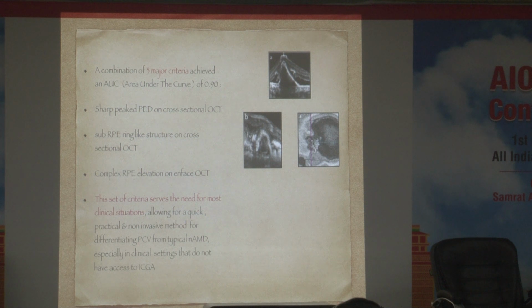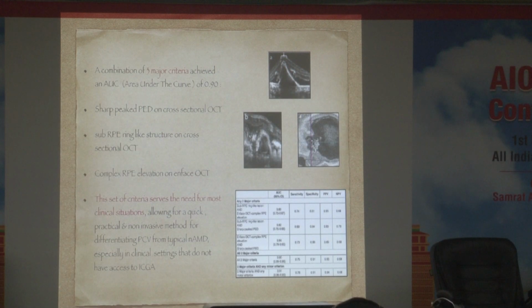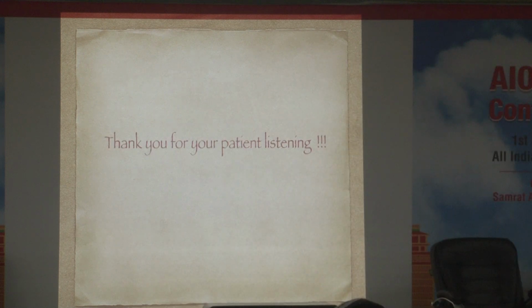This set of criteria serves the need for most clinical situations, allowing for a quick, practical, and non-invasive method for differentiating PCV from typical neovascular AMD, especially in clinical settings that do not have access to ICGA. Thank you.